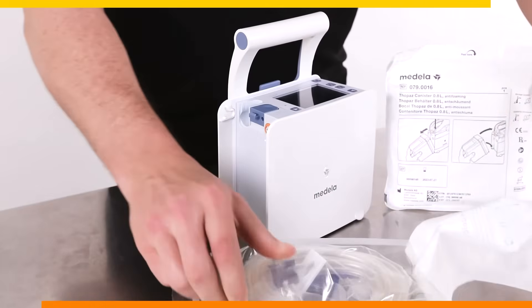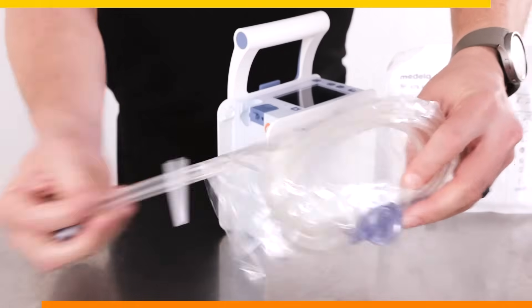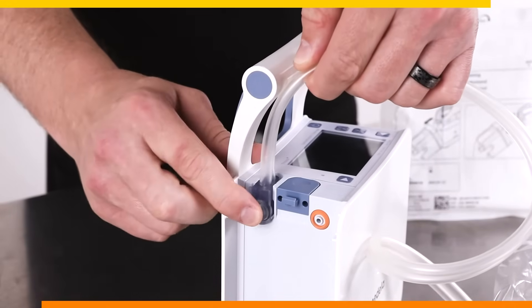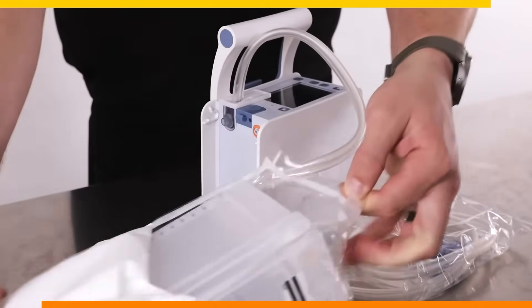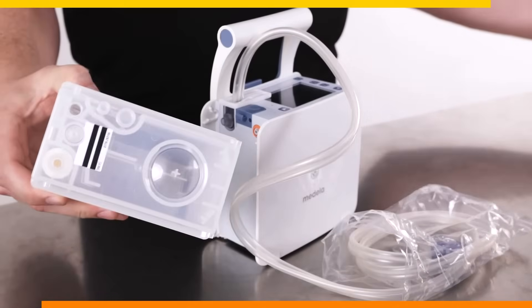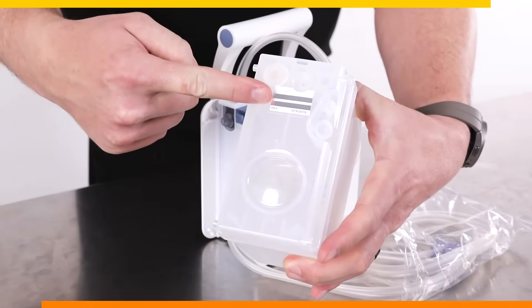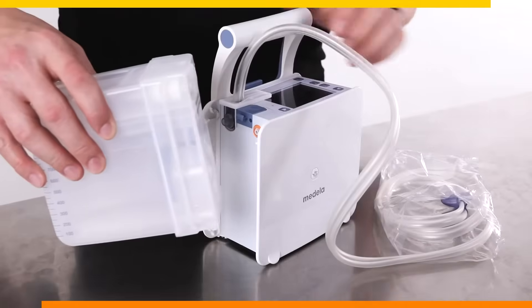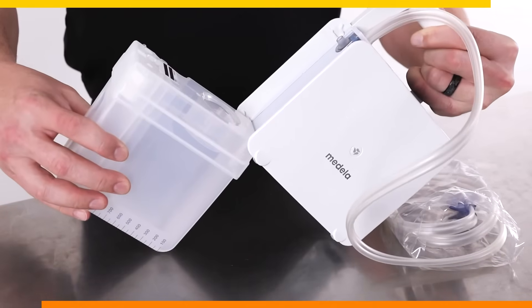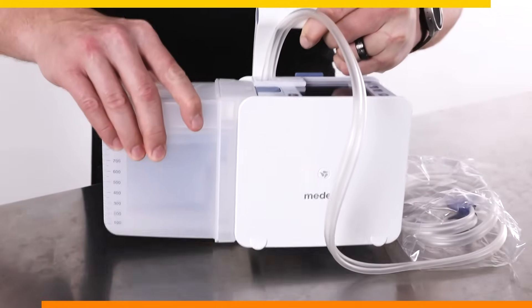Carefully open one end of the tubing packaging, ensuring that the pointed patient connector end remains sterile. Carefully insert the other end into the Topaz Plus suction port. Next, open the canister and check to ensure that the canister detection label is present. If it is not present, do not use the canister. Ensure that the orange O-ring is present, and take the canister and fit the feet first at the bottom of the device. Then rock and lock the canister into place until you hear a click.